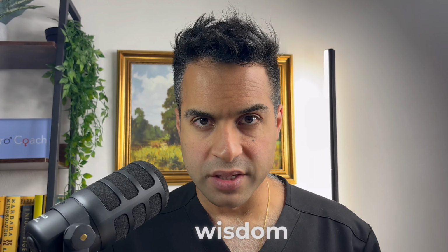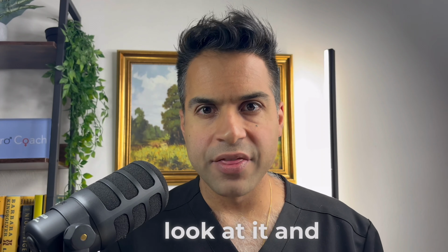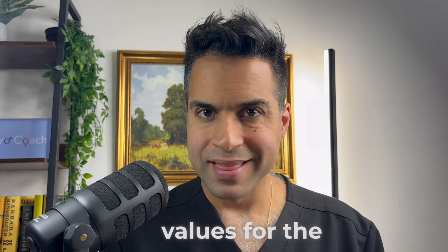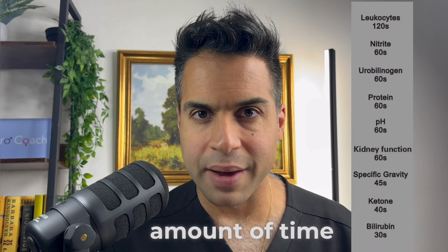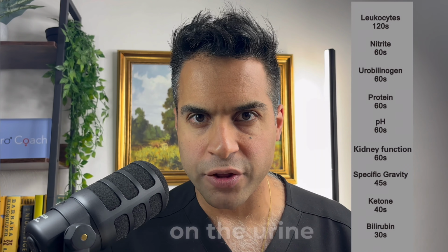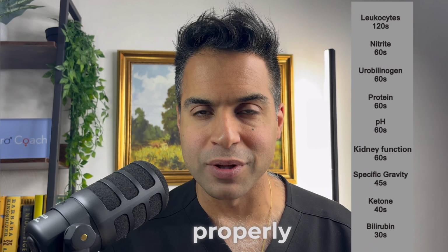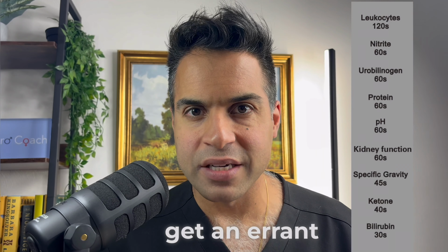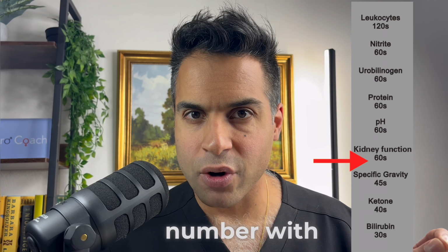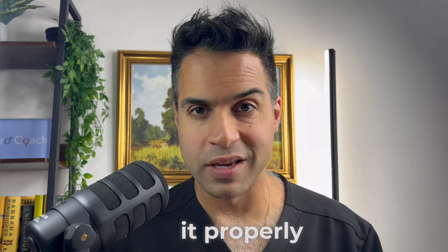And this is my pearl of wisdom. So when you see a urine dipstick, some people will look at the urine dipstick and they'll get multiple different values for the same urine specimen. And what's really key is if you look at this diagram here, you have to make sure you wait the right amount of time. Each one of the values that we are measuring on the urine dipstick requires a requisite amount of time before you can interpret it properly. If you try to interpret it too early or too late, then you may get an errant value, okay? So you see that number with the letter S next to it? That's the number of seconds you have to wait to interpret it properly, and that's super important.